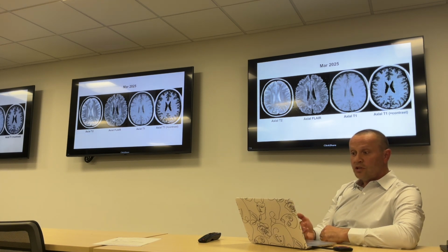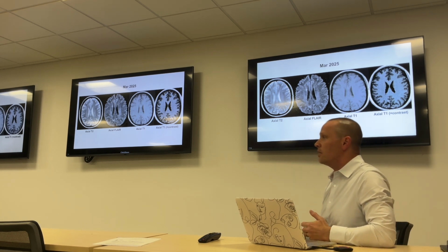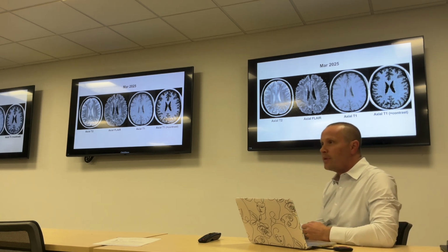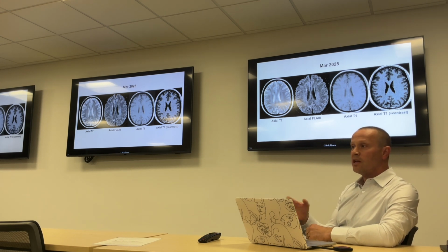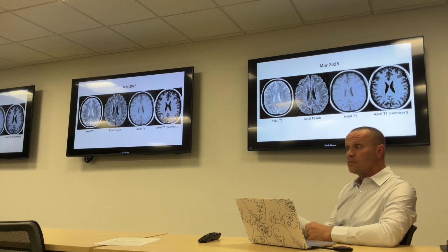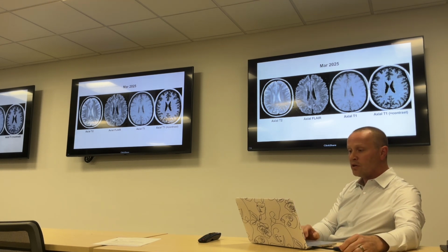Whenever we see a new lesion, especially, I guess with all lesions, but mostly when we see new lesions, we also want to see, is it an active demyelinating plaque? The active demyelinating plaques are typically the ones that cause the symptoms. They're typically the ones that cause new symptoms, when you have a flare-up, which is when you have a new acute lesion.